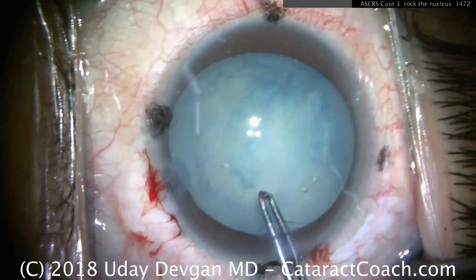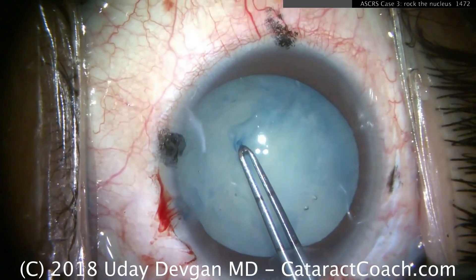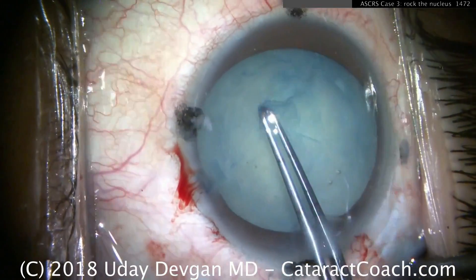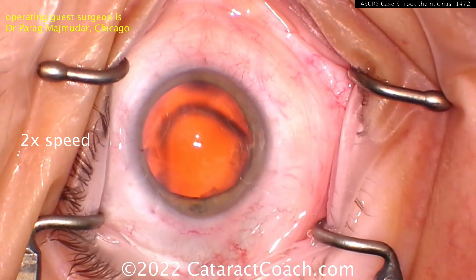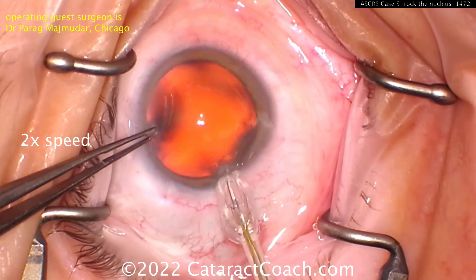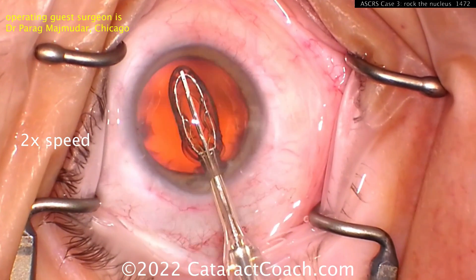Now with forceps, watch carefully — there are a couple of attachment points still. Grab that anterior lens capsule — look, one, two. So it's still attached at some points. Now, arguably, a better option may be doing a device like this, the Zepto device.